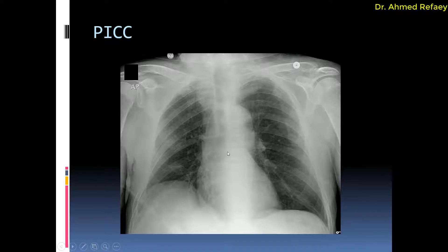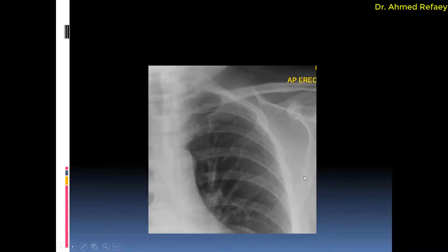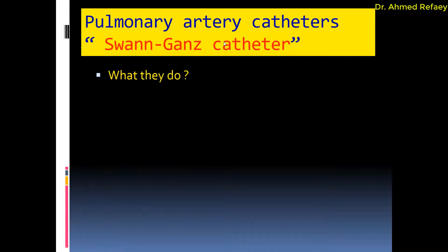This is an example of malpositioning of a peripherally inserted central catheter, malpositioned in the left internal jugular vein. As you see, the catheter comes from the left antecubital vein to the axillary vein to the subclavian, but instead of going to the left brachiocephalic vein, it is directed into the left internal jugular vein.